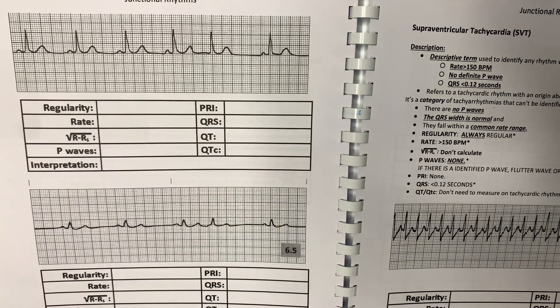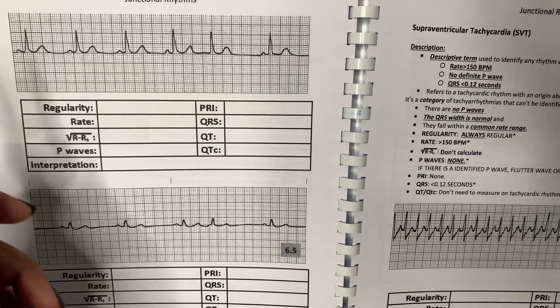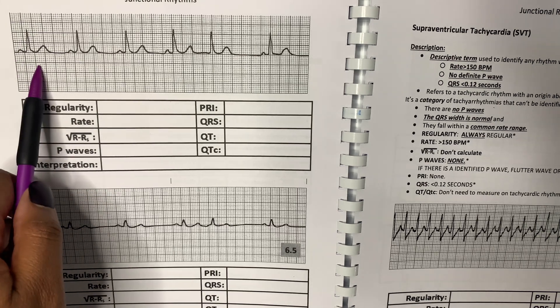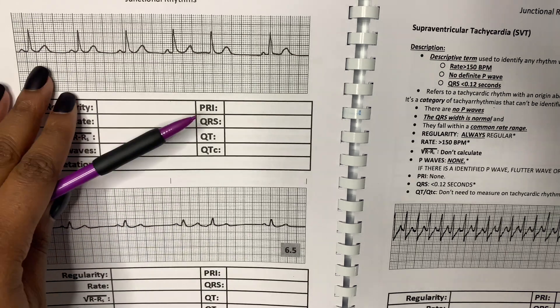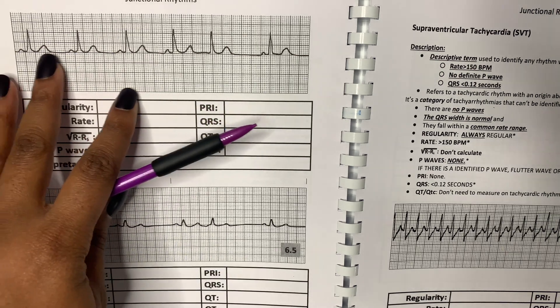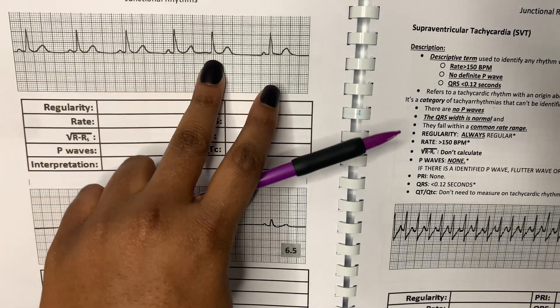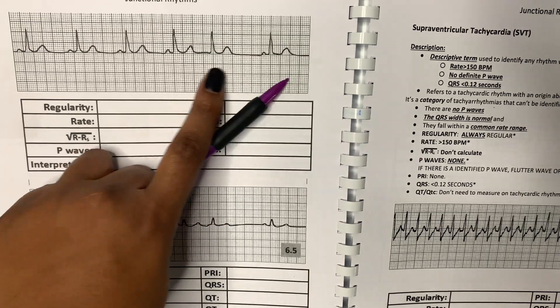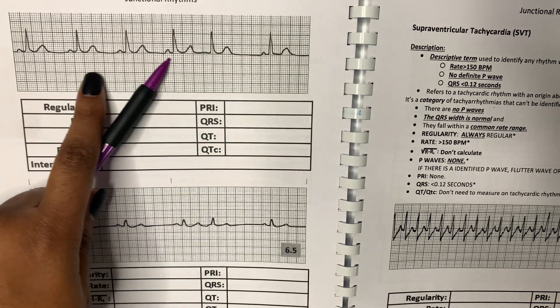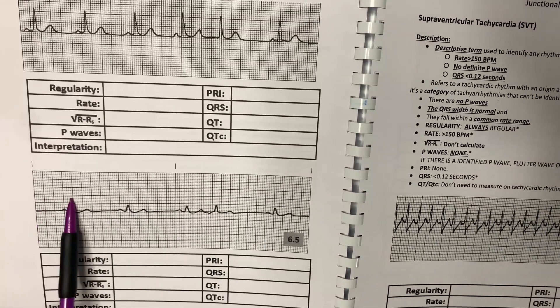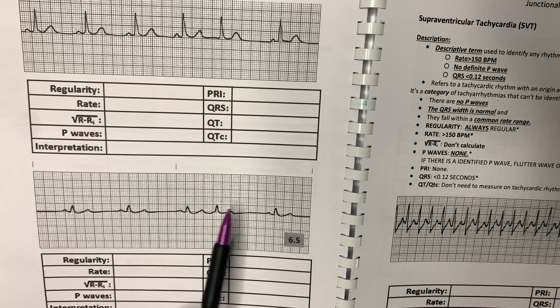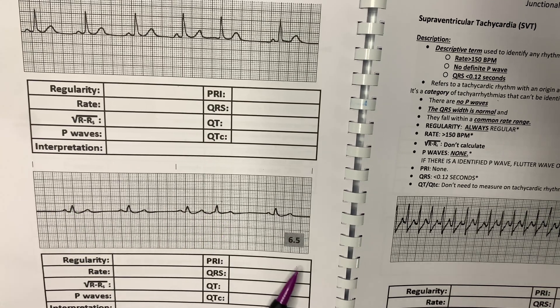Another hallmark with PJCs is that it does not disrupt the ventricular conduction pattern — meaning the QRS. If you look at this PJC, the QRS is exactly the same as the rest of the QRS complexes. And if you look at this rhythm, same thing — the QRS does not change. It's just the P wave.